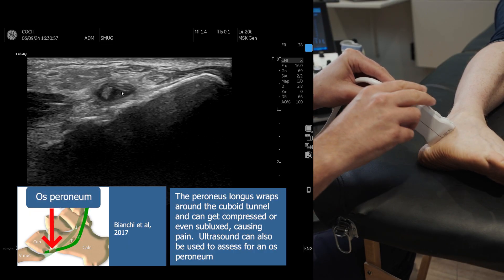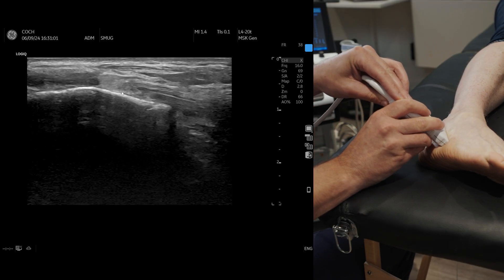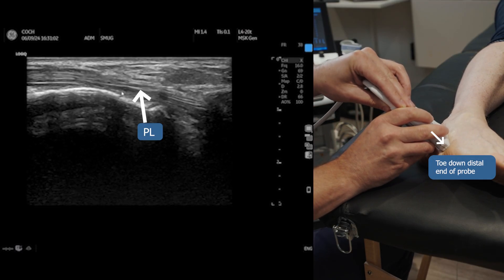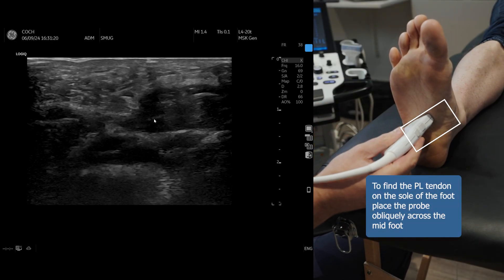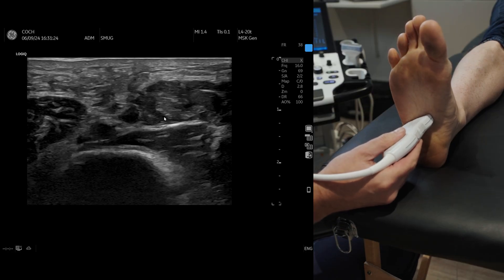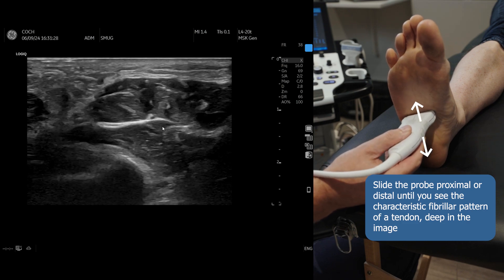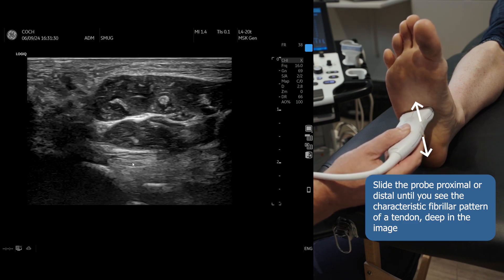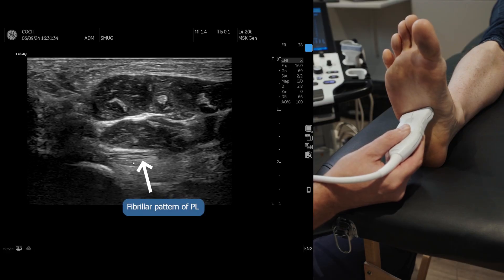You cannot follow it all the way, but if you get a nice long section and toe down the probe, then you can see the peroneus longus. The best way of finding the peroneus longus under the foot is to place the probe at an oblique 45-degree angle. Go towards the heel and come more proximal, and you start to pick up the fibrillar pattern of the fibres there.